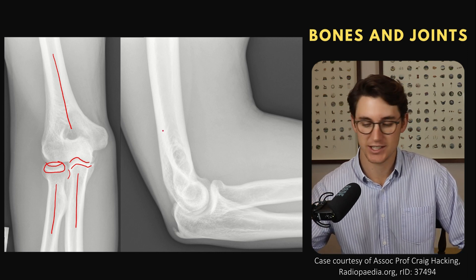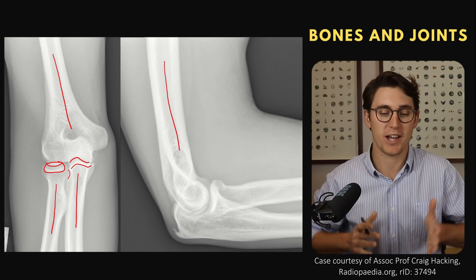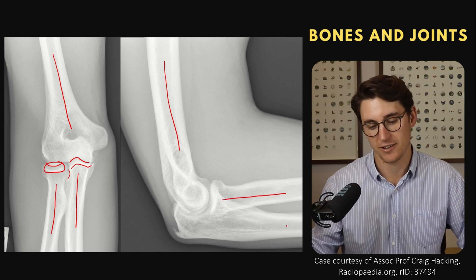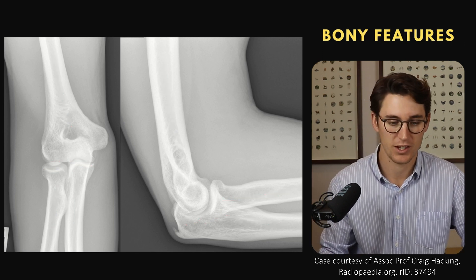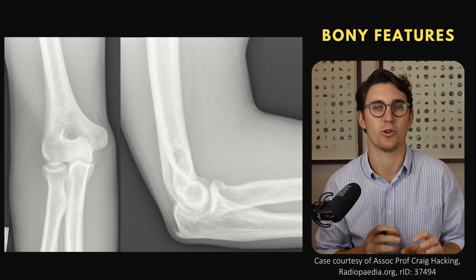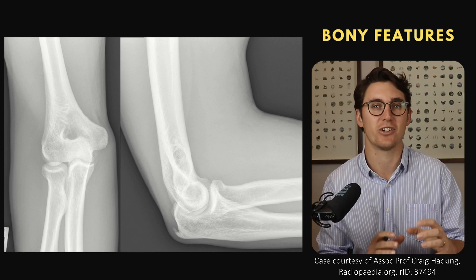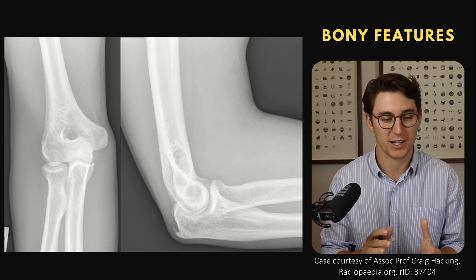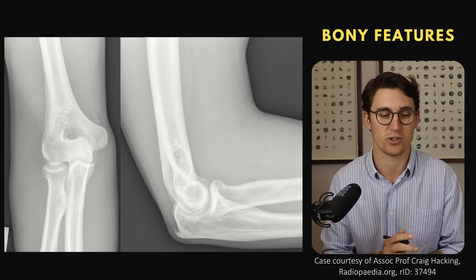Looking from our lateral X-ray, we can see our humerus coming down — it becomes shallower as we get more distal. Then we have our radius and our ulna, which wraps round posteriorly allowing for flexion and extension. Now there are only three bones making up the elbow joint, but each has different sections we need to know about. They generally follow the ossification centers of the elbow. Those ossification centers eventually ossify, fuse, and make up this complex anatomy of the joint.